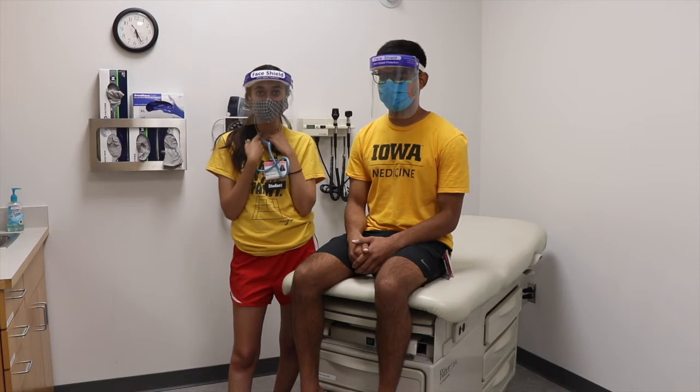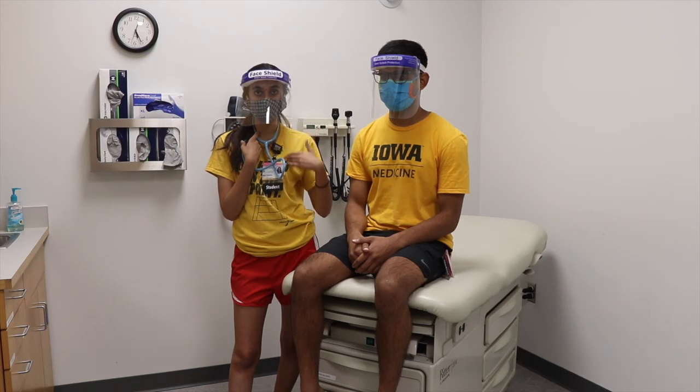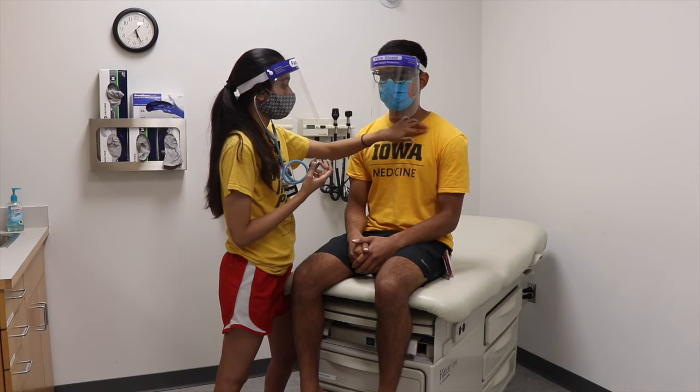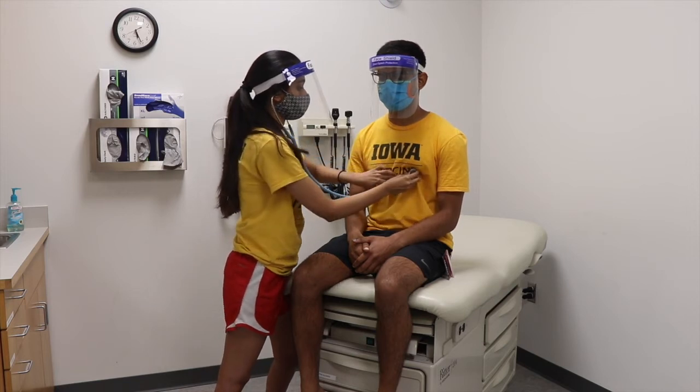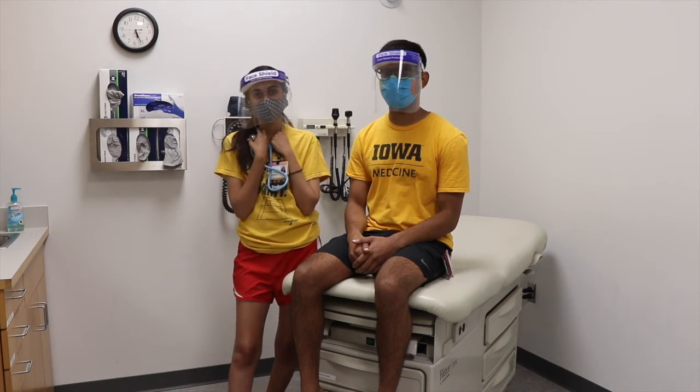And the last one we'll listen for is the mitral valve. The mitral valve is going to be in the 5th intercostal space on the left side, but it's going to be in the center of the clavicle. So that's called your midclavicular line. And that's how you auscultate 4 valves.